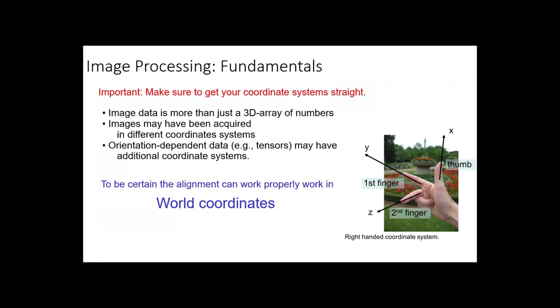All right. So before we work on the image, there's something we need, some standards. First, because this is a 3D image, we have to have a standard manner to describe the image. What is X, what is Y, and what is Z? For a 2D image, we don't have a problem, because if the face is upside down, we just rotate.